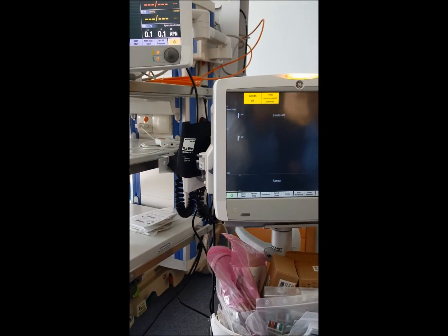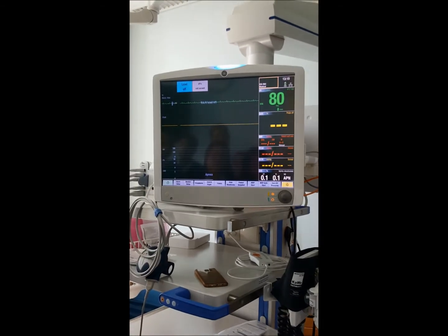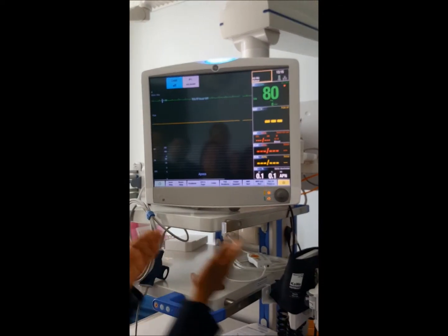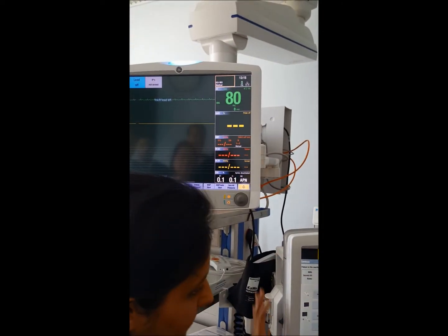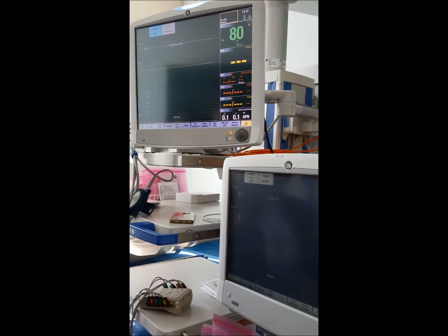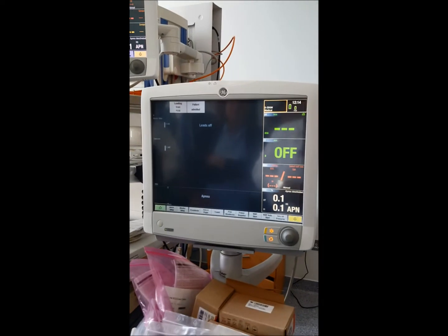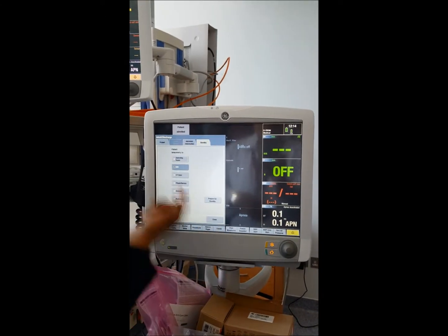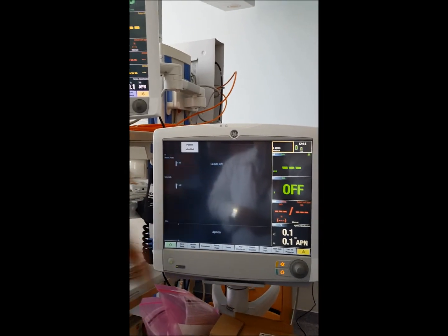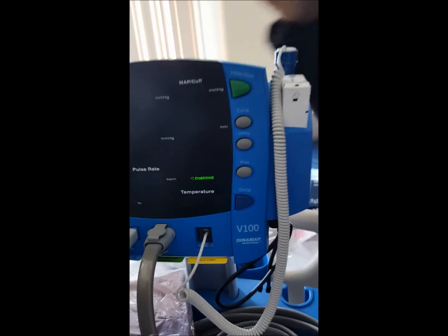This is a very intelligent, user-friendly monitor. Switch it on, connect the patient, and all data appears automatically — only for NIBP do you press the button. This big unit is the B850 and the smaller one is the B650. The monitor family is called Carescape: CareScape B650, CareScape B850, and CareScape V100. This one is stationary, the other is mobile, but they all operate on the same platform.